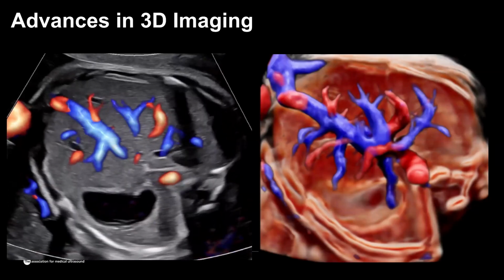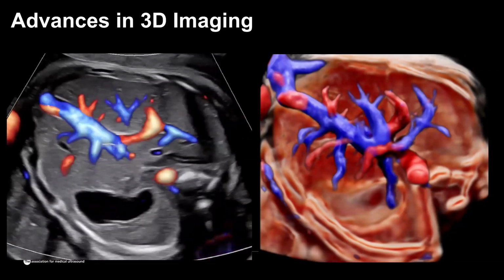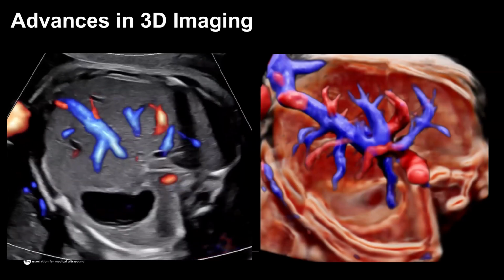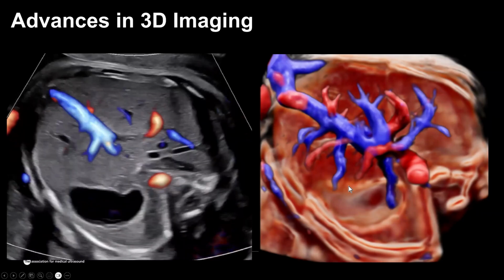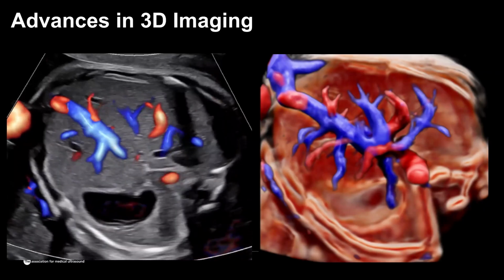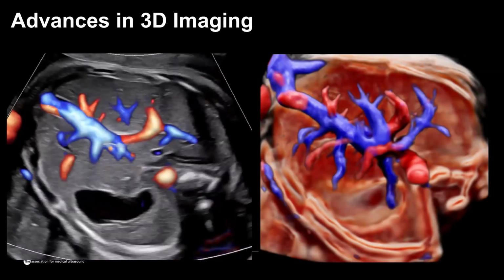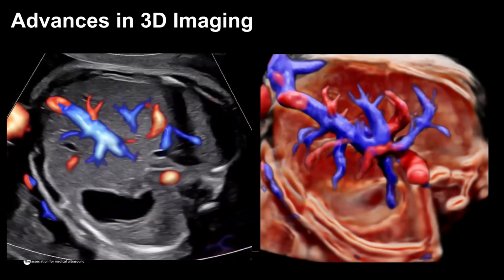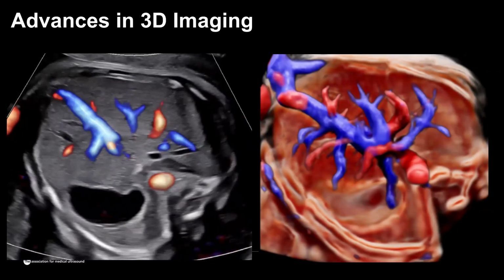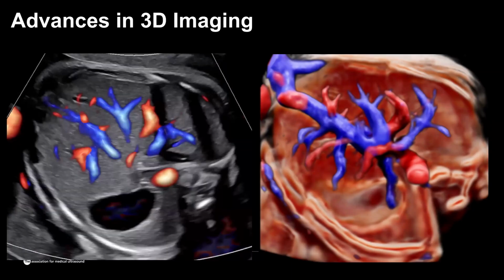So as I said, any type of color can be combined with the 3D imaging, and it could be the thin static 3D acquisition or the STIC technology. And here you can see the vasculature of the liver. Again, this is a very important thing to look at because some malformations may involve the system, and there are a lot of different structures, so the 3D helps the spatial orientation between them. This is the application for which I use imaging with 3D and color most of the time: the evaluation of the anomalies of the umbilical portohepatic system.